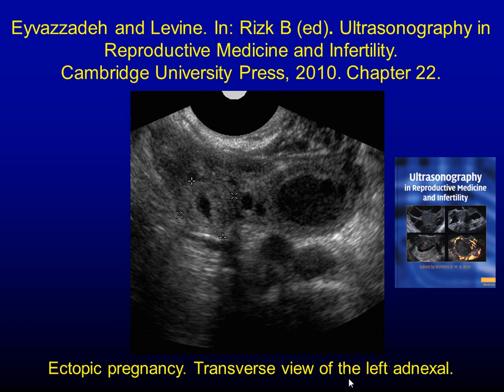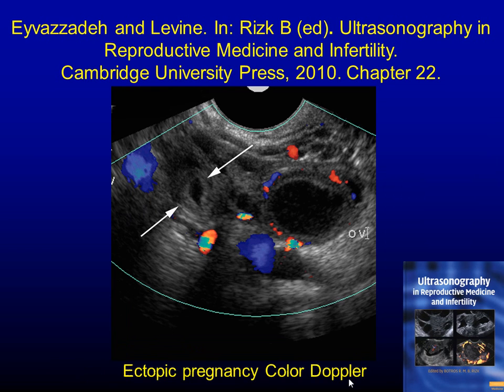And again, ectopic pregnancy here, seen very nicely. The ectopic is where the crosses are. So this is the ovary, and this is the egg. So this is a corpus hemorrhagicum. Corpus hemorrhagicum is a normal finding after that. But here is the ectopic, and there is the sac there. Again, ectopic was the sac.